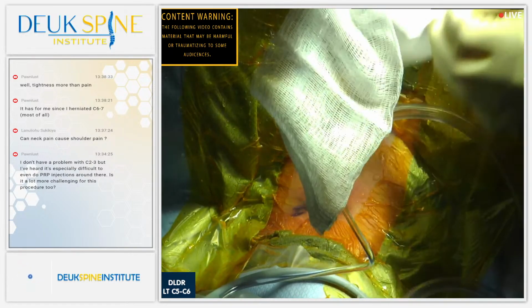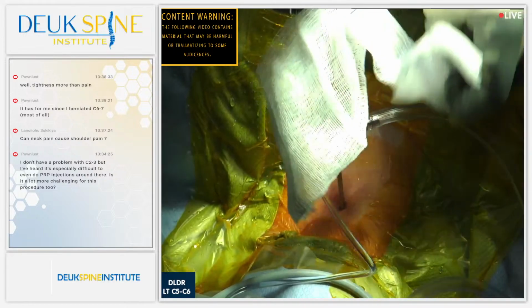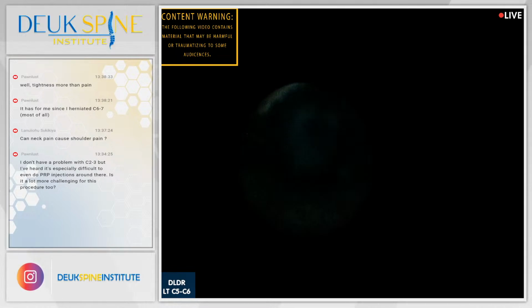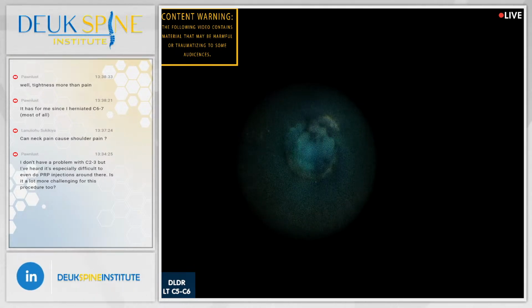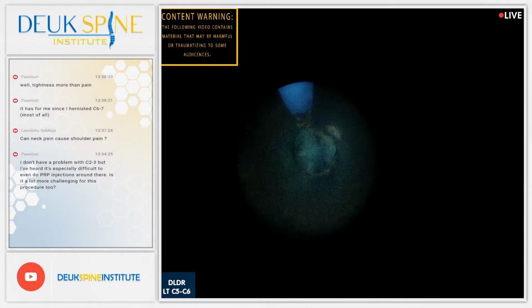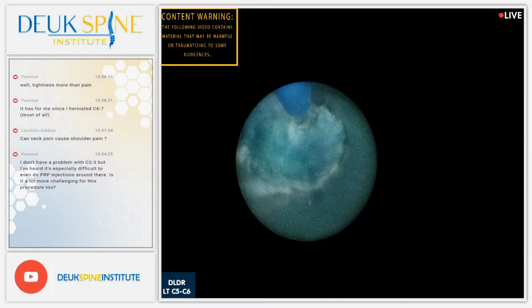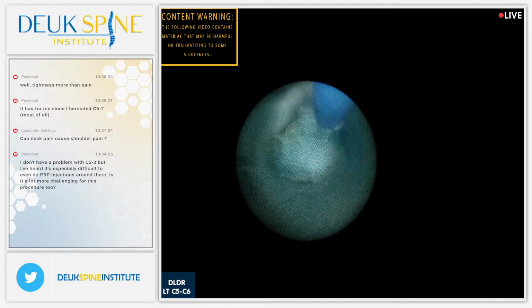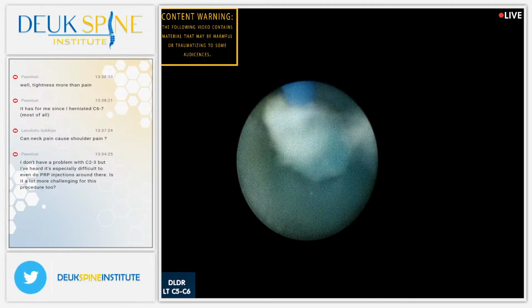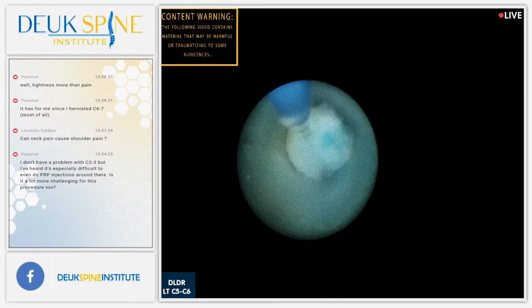military activity maximum. With the old degenerated disc, you're talking about burned out areas that saw action many years ago, and there's a little bit of inflammation left. That's kind of the guerrilla fighting that's happening in the burnout buildings. I'm having trouble seeing because that light's right in my eye. Thanks. Great question, though. This is a fresh herniation. That's why it's so blue and soft. All right, let's keep the questions coming.